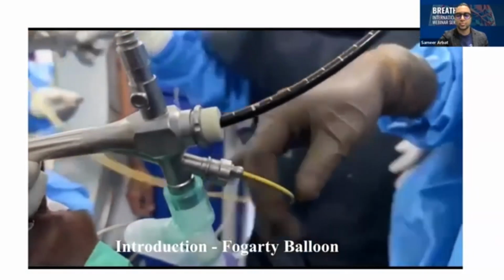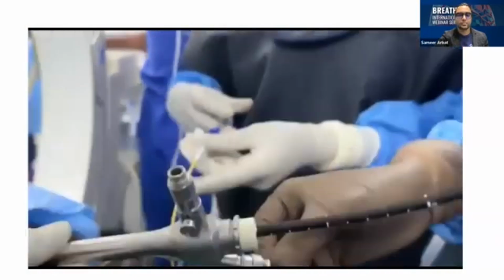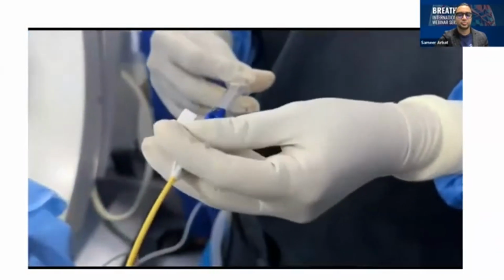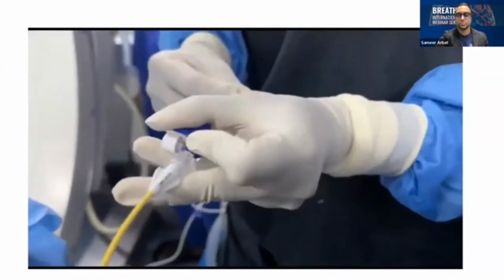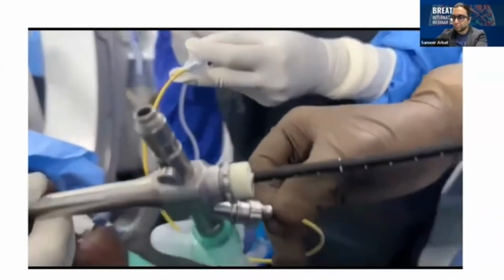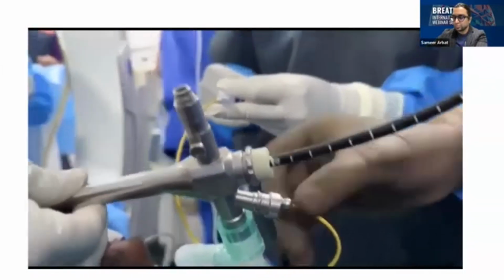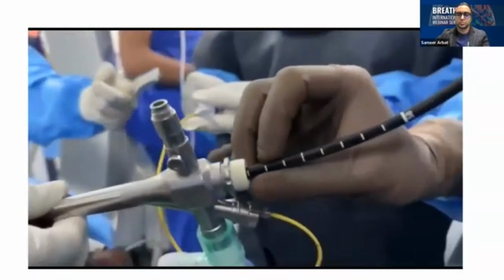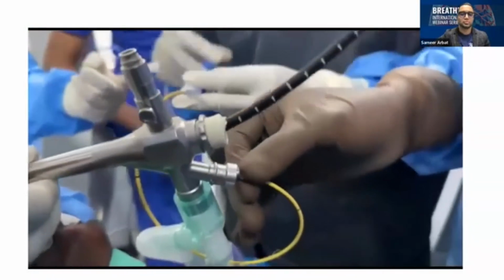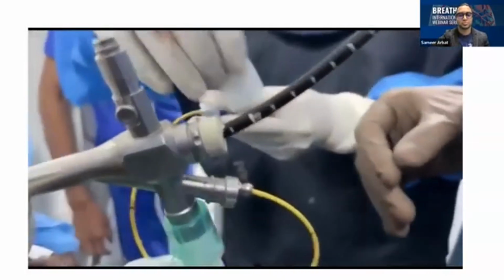Once this Fogarty is passed, it is checked to see if it is in the particular segment where we want it. We are checking with the help of an assistant, who is checking whether the Fogarty is functioning in place or not. Once the Fogarty is passed, you can see that I will be securing the position of the Fogarty with the help of a tape. Then we go inside with the help of a cryoprobe and take a biopsy.